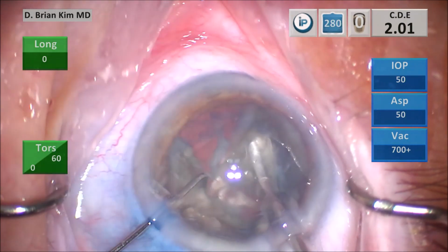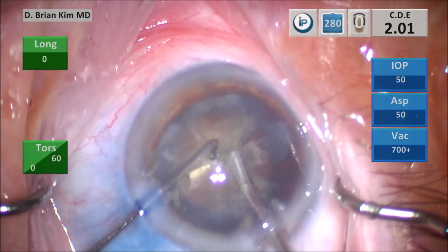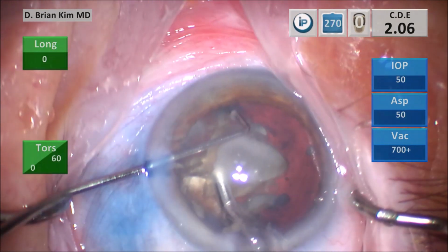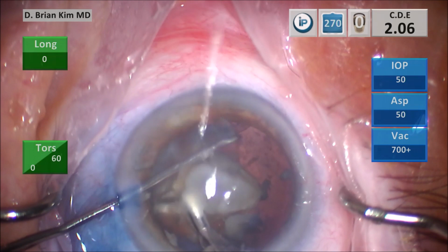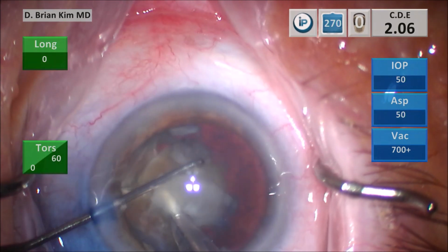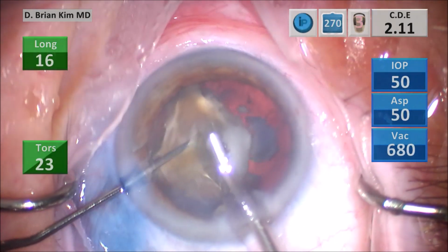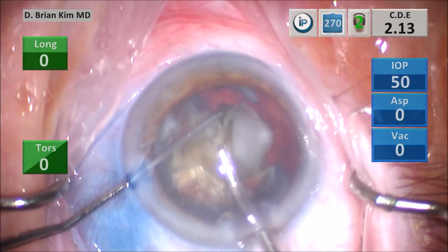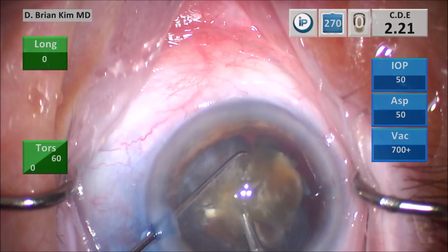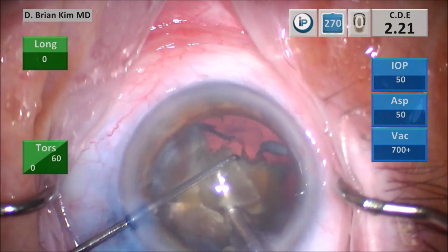Almost. There it goes. So finally separated the posterior adhesions, using some vacuum to lift that piece up, getting around it with the chopper, making sure I don't snag the anterior capsule, and then crushing the lens. Again, the lens is so big and it's just requiring a lot of patience and time to get around the lens piece and very carefully chopping the lens up into smaller pieces.